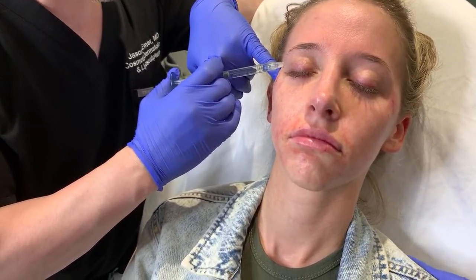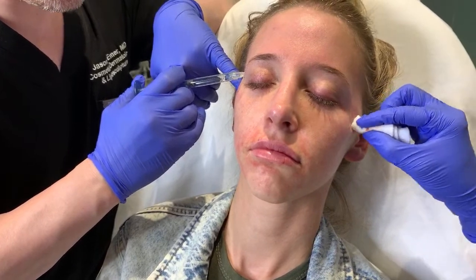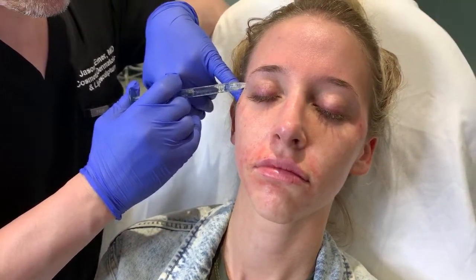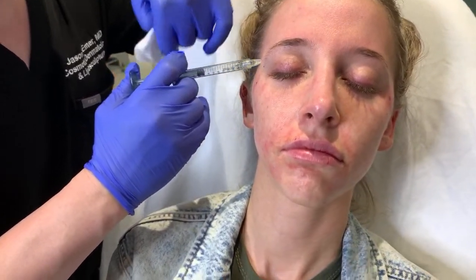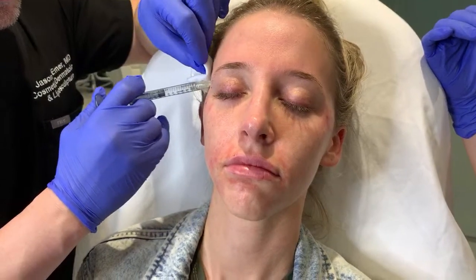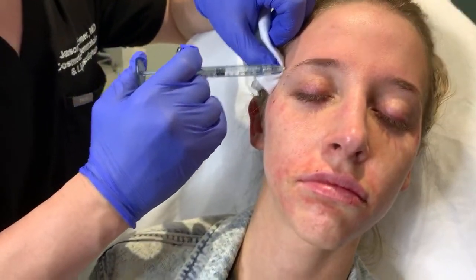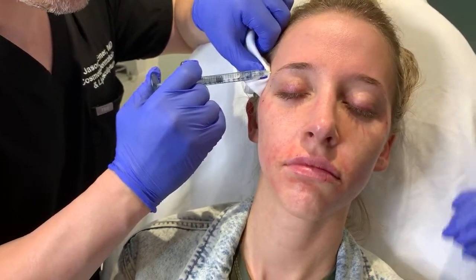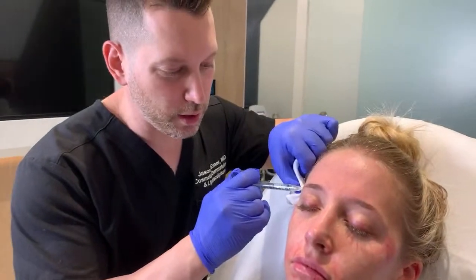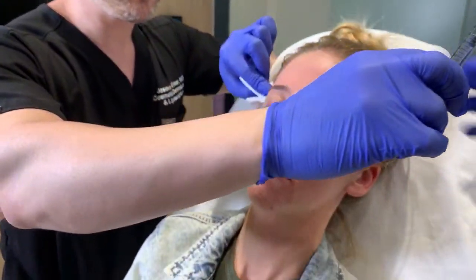Now, she probably needs more than one syringe here, but what we're gonna do is just do a little bit to start so she gets used to it and feels comfortable. We're going underneath all the blood vessels, so that's a very safe area. And we're using Juvederm, which will hold a little bit of water as well to give us some substance in this area. Now we're gonna go one more little poke right up in the middle here, a little bit higher, right again onto the bone there. We're just doing a very soft injection, and this will support her brow as she ages too. She doesn't really have sagging right now, but you never know what happens in the future, so we want to be preventative.